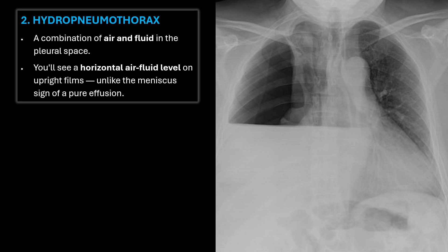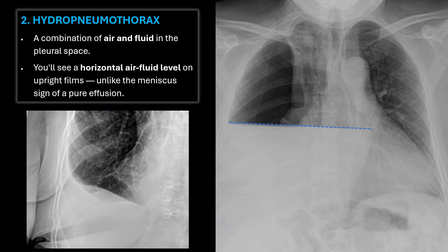Second is a hydropneumothorax, where you get the combination of air and fluid in the pleural space. You'll see a horizontal air-fluid level on upright films, unlike the meniscus sign of a pure effusion, as we see here on the left.